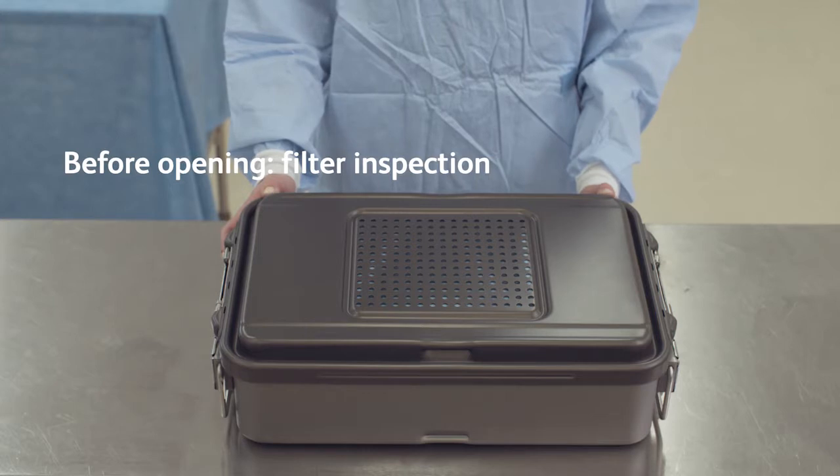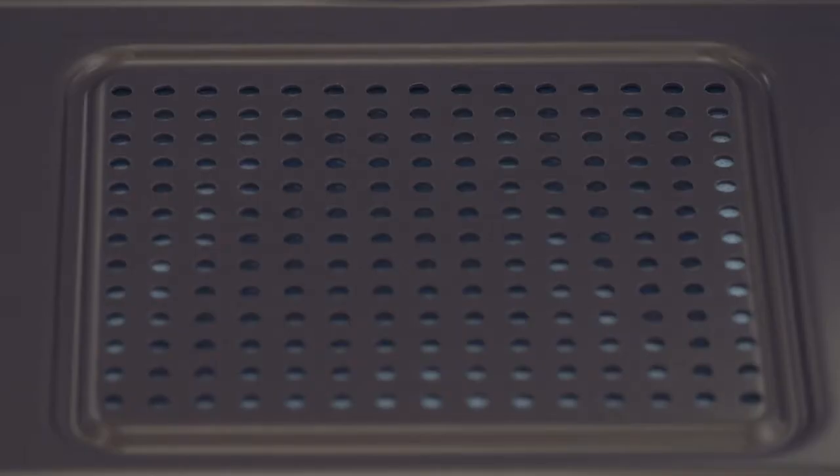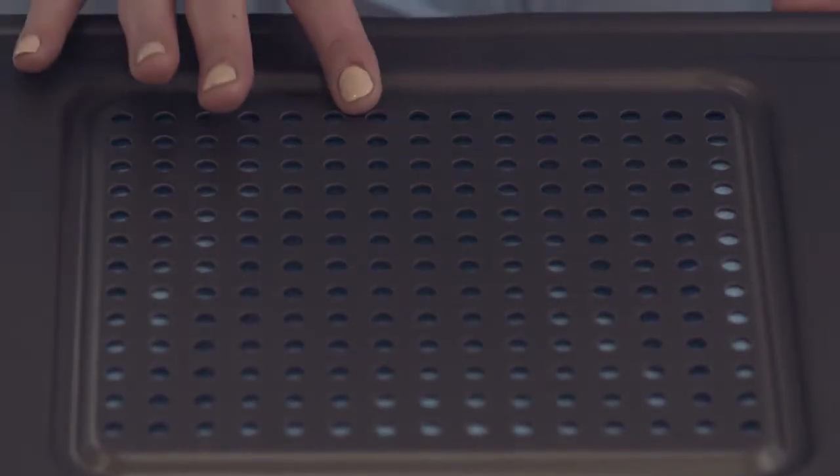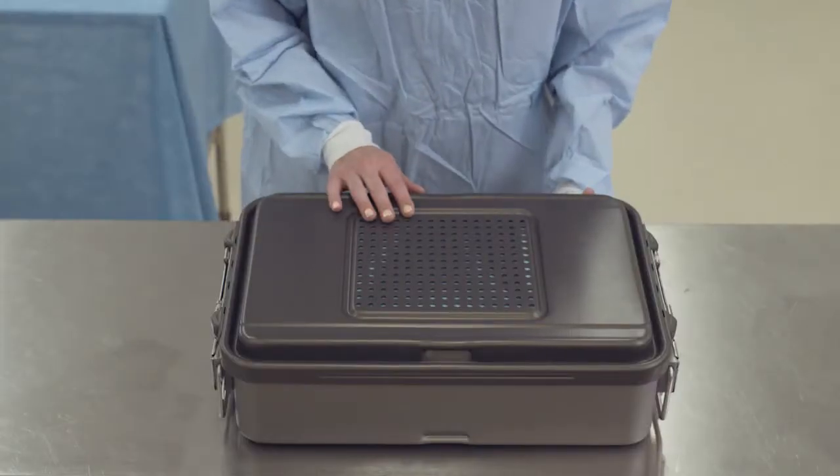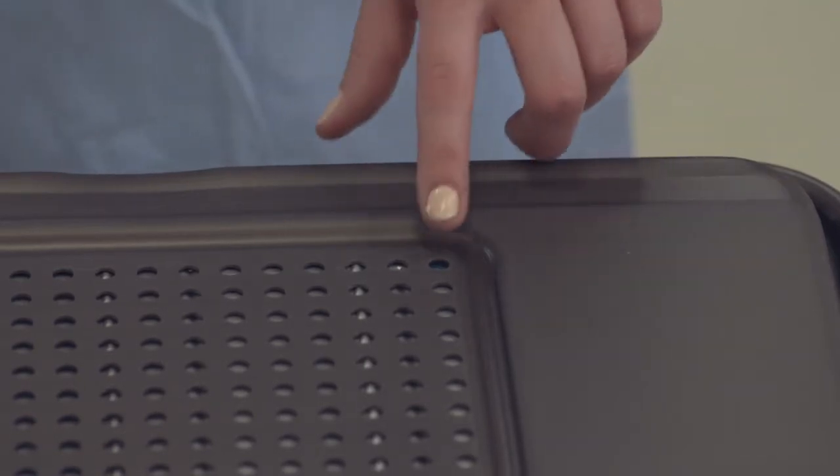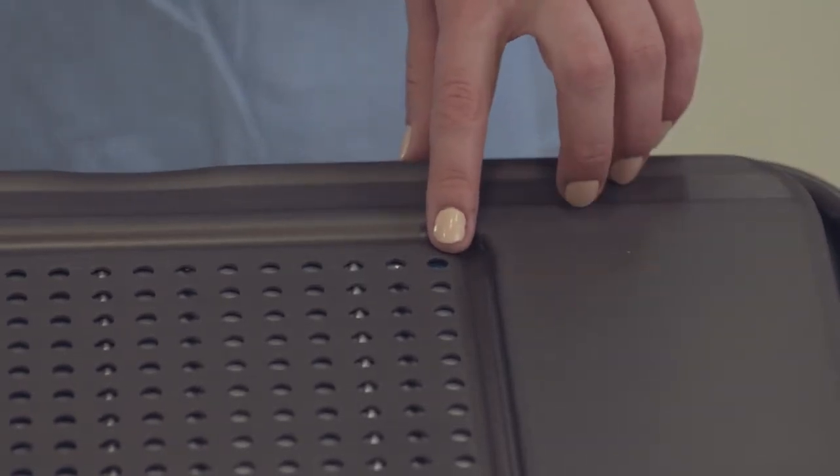Inspect to ensure the filter is in place. The filter color will show through the perforations on the lid of the container and container bottom. If the optional protective plate was used, the filter color will show through a single corner of the perforation area.